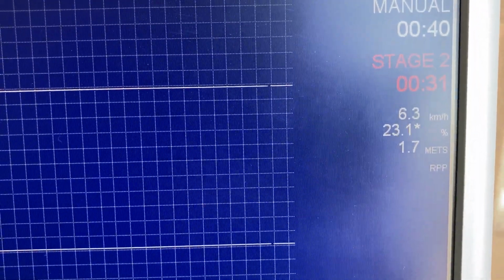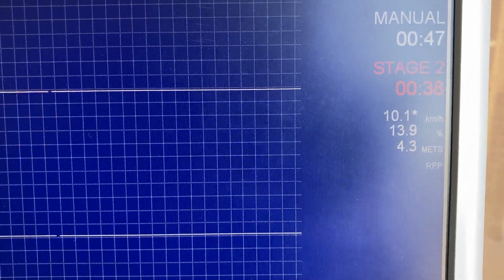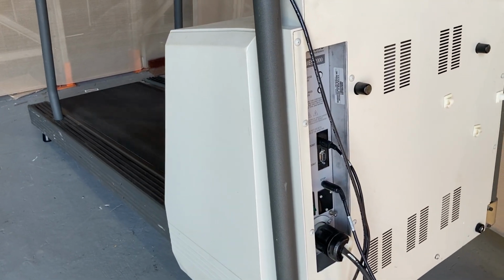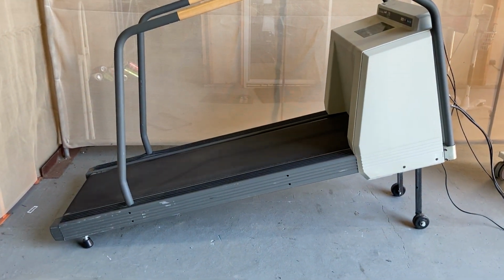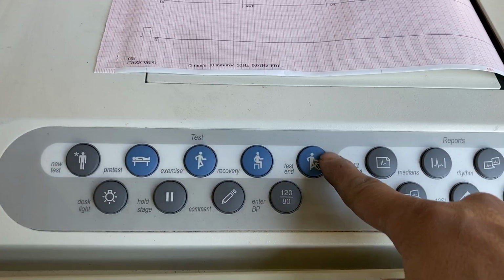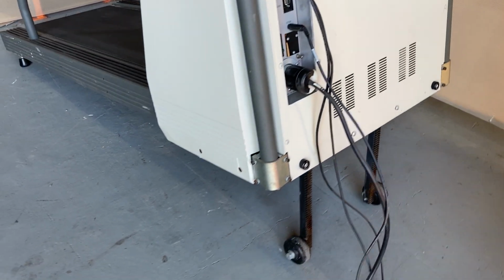The max is 25 degrees or 25% incline, and the maximum speed is, I think, 13.5 miles per hour, which is about 22 kilometers per hour. So crank it up to about 20 kph. And there you have it.